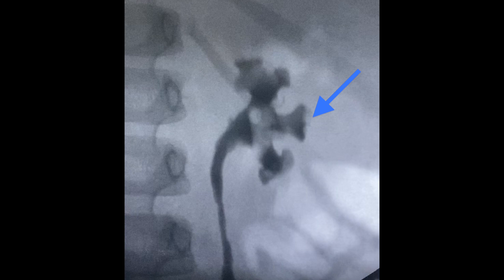After the RGP was done, you can clearly see the calyces. The one pointed out here is the mid anterior calyx, which is generally seen more laterally. The mid posterior calyx is not so clearly seen — to identify it, you have to look more medially compared to the anterior calyx. The arrow points to a small radiodense shadow slightly medial to the mid anterior calyx. This is the calyx you need to puncture for a mid posterior caliceal axis.